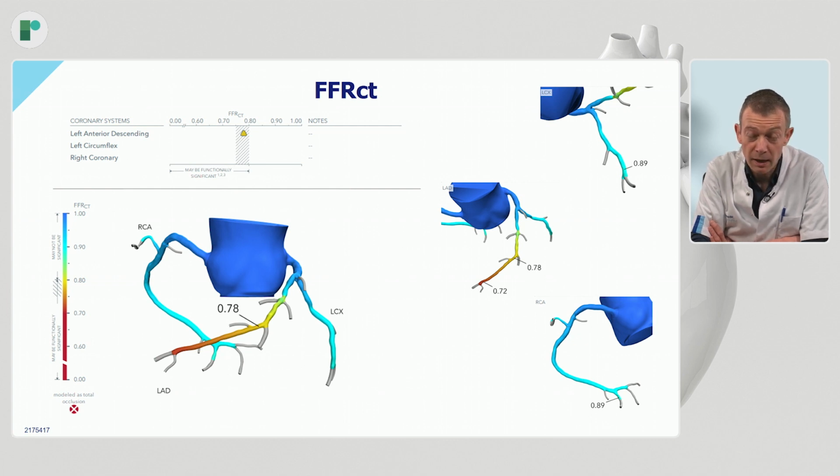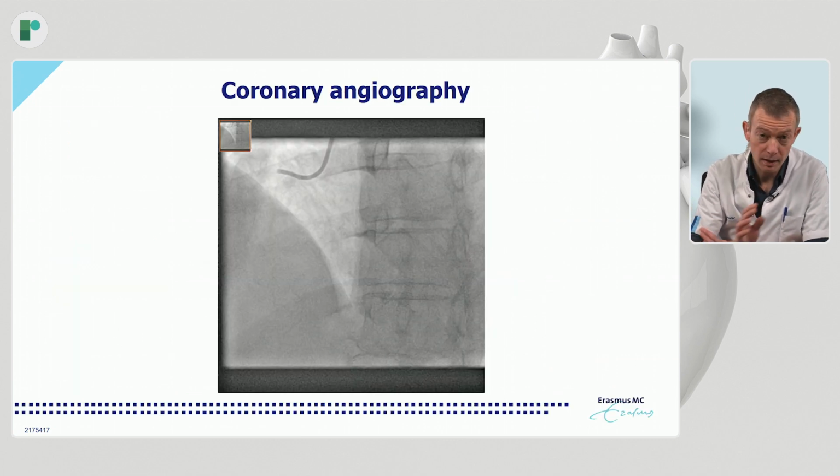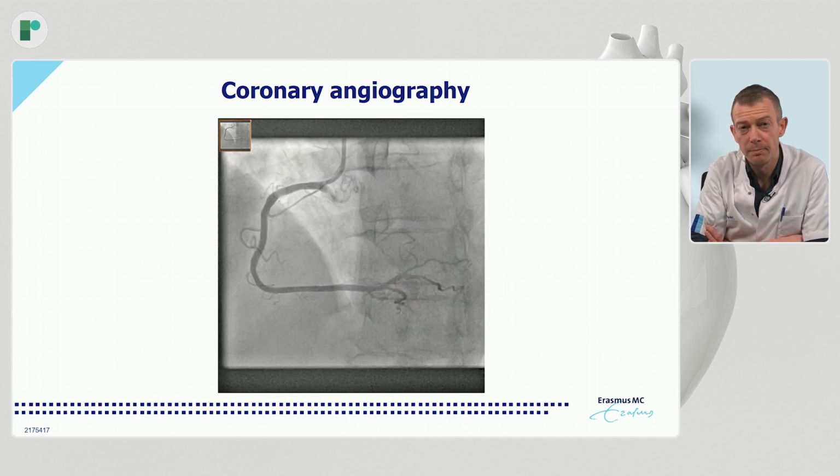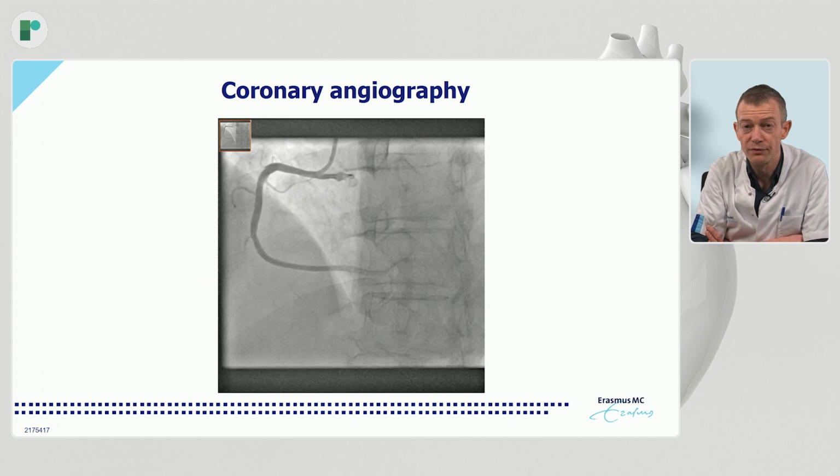So with that, absolutely helpful and even more reason to take this patient for an invasive coronary assessment with the option to treat with a stent or potentially even a LIMA, depending on the type of disease. So this was the angiogram showing you the right coronary as anticipated, completely free of any type of relevant disease.